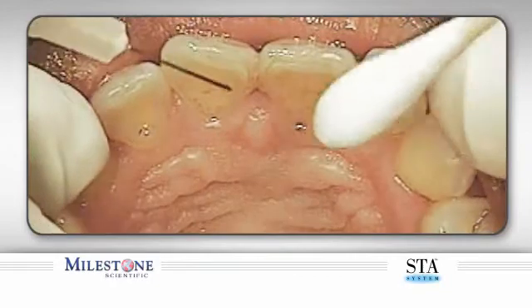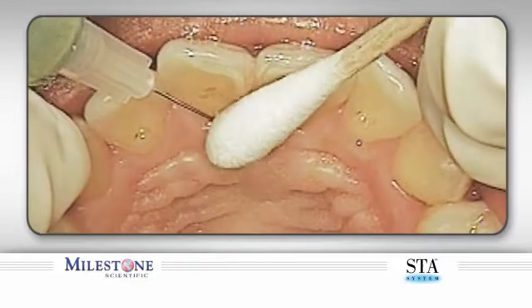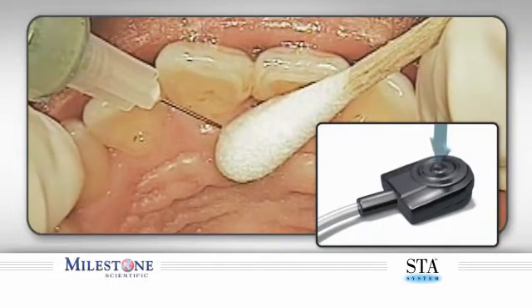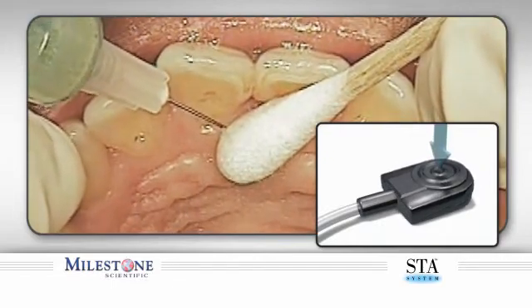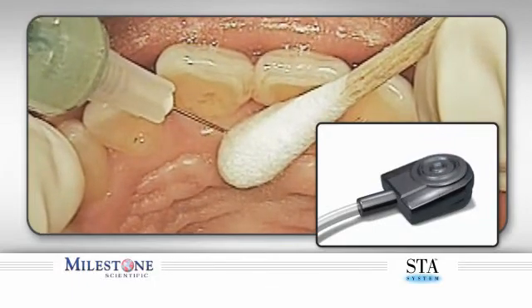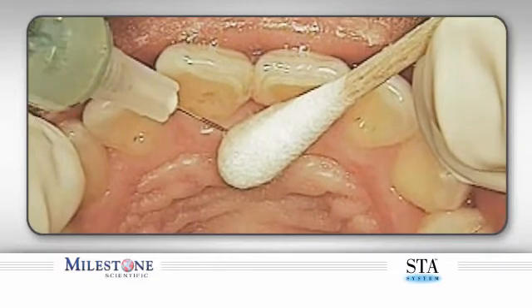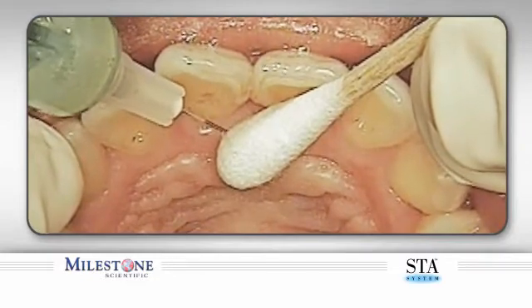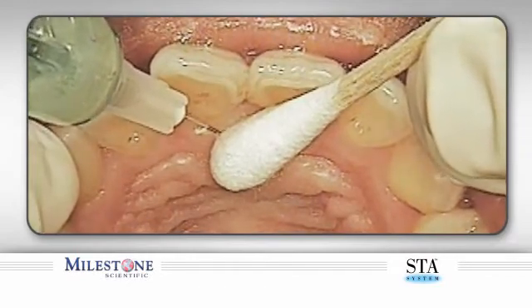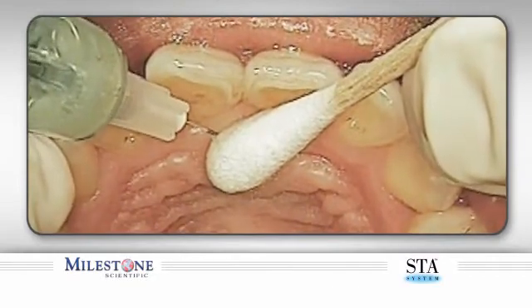We will now show a clinical example of the PASA injection being performed. You can see the needle is applied to the surface of the palate, followed by the placement of a cotton applicator. The flow of anesthetic is begun by initiating the STA cruise control. Once the needle bevel enters the tissue, pause forward movement for an additional four to five beeps before advancing again. Next, simultaneously advance the needle one to two millimeters while rotating back and forth. After the papilla has blanched, re-orientate the needle more vertically to gain entrance to the nasopalatine canal and continue to advance the needle very slowly while simultaneously rotating with bi-directional rotation.